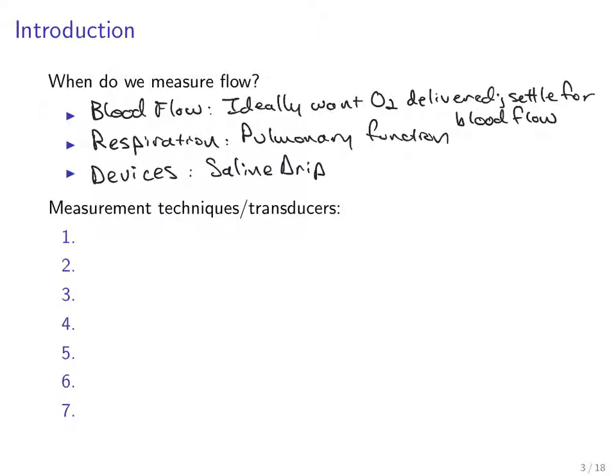So in this lecture, we'll talk about several different techniques for measuring flow. The first of which is just an illustrative example, which is a bucket and a stopwatch.